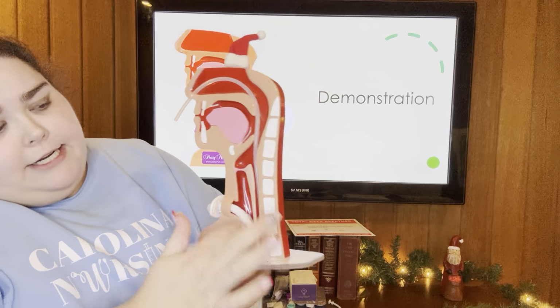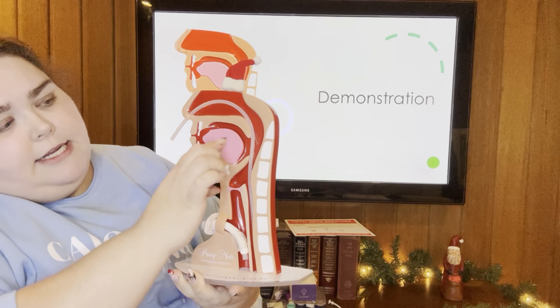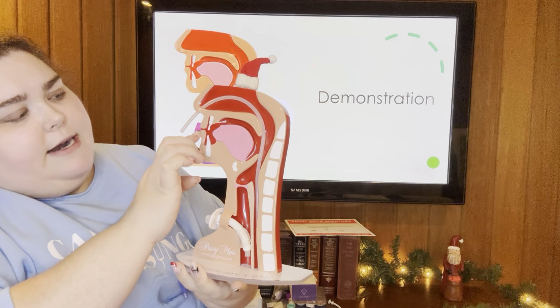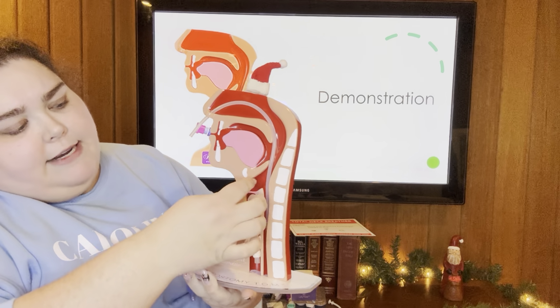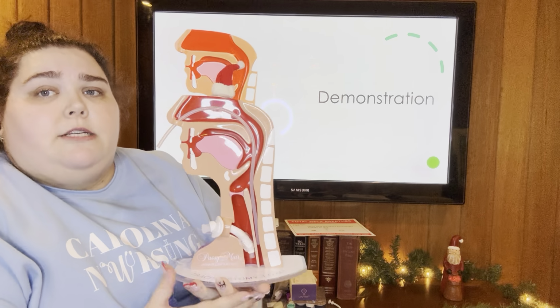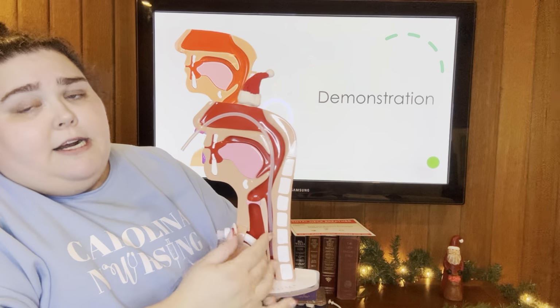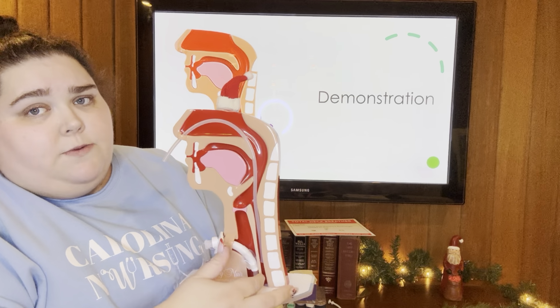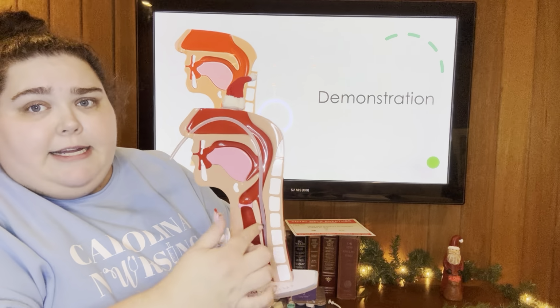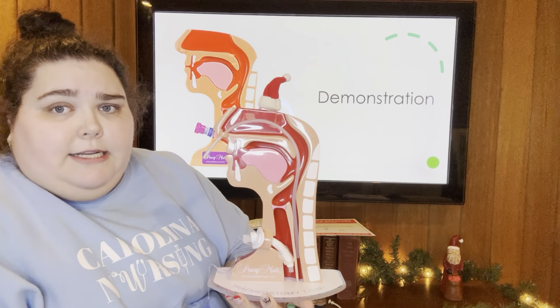So the trach sits here. This is his trachea. You can see it attaches to his mouth right here, he breathes through the oral cavity and then down into the trachea. This is his NG tube because Tom is an ICU patient. He's got a lot going on. So we have his NG tube in there, and that shows you where his esophagus is as well. So his esophagus is back here. His trachea is here. You can see that it's clearly got some delineation there.